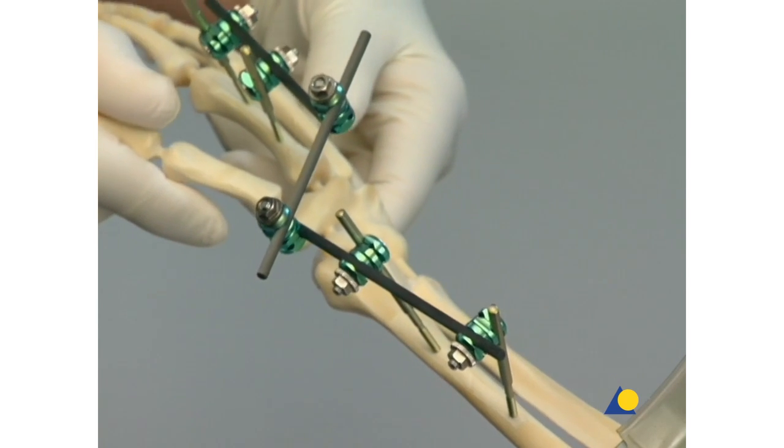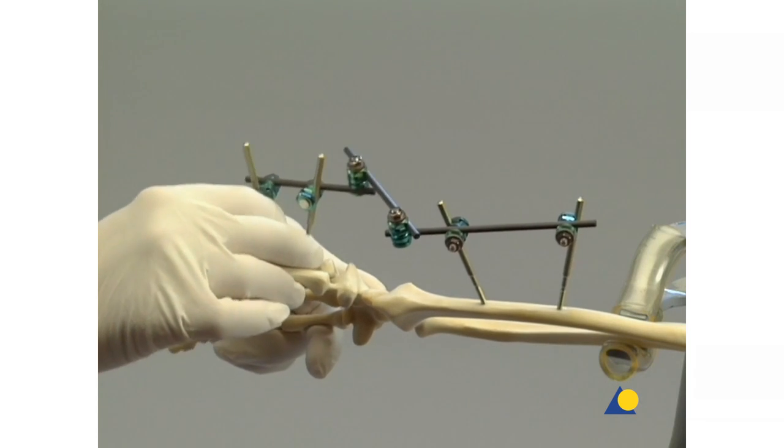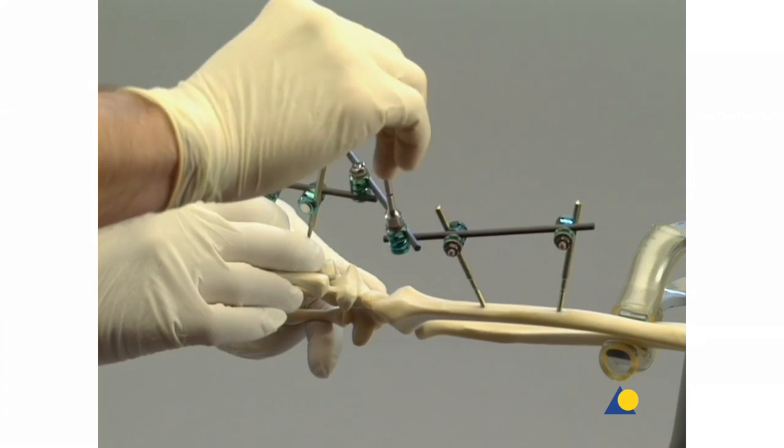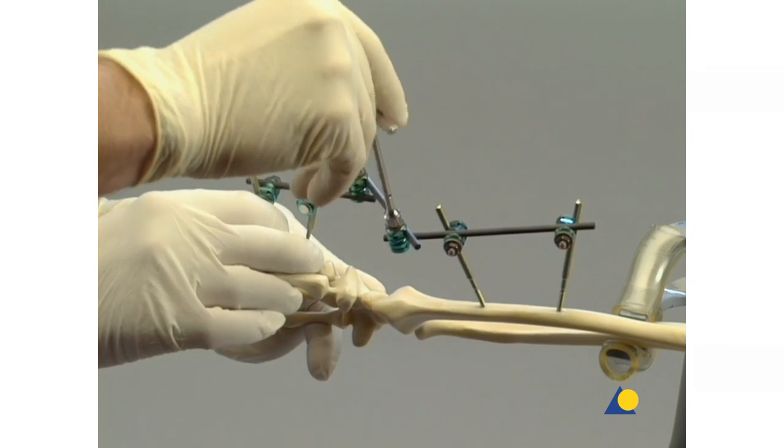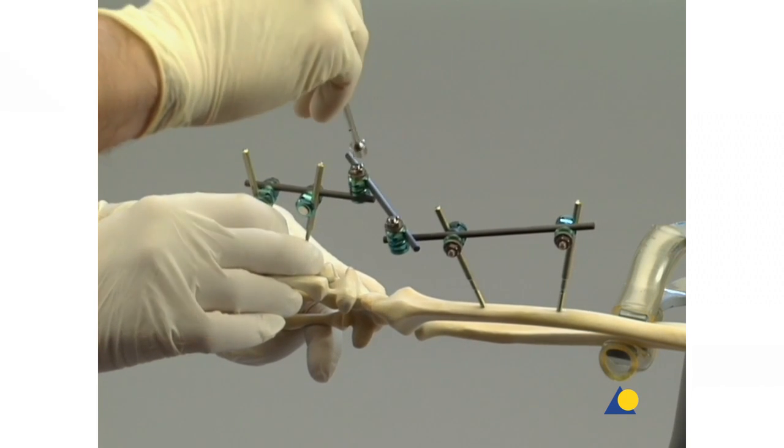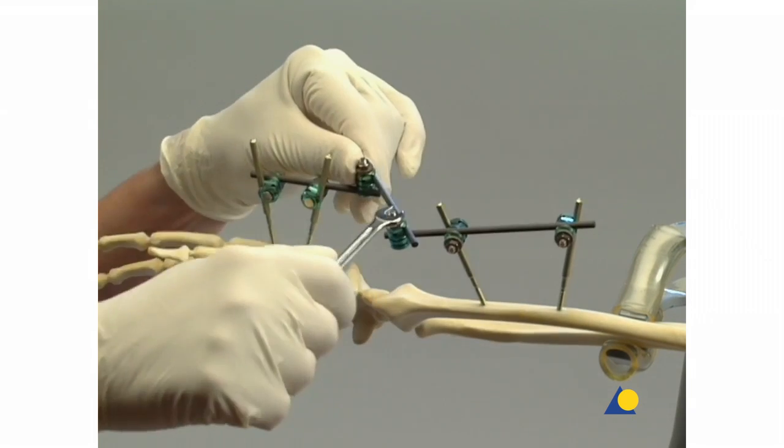The fracture is reduced and the reduction is verified under image intensification. The reduction is maintained by hand and the nuts of the combination clamps are tightened alternately.